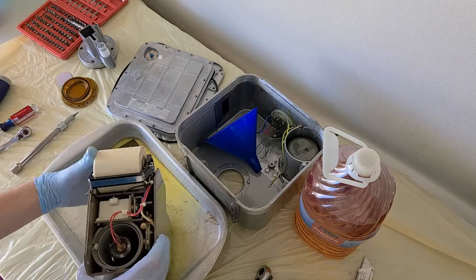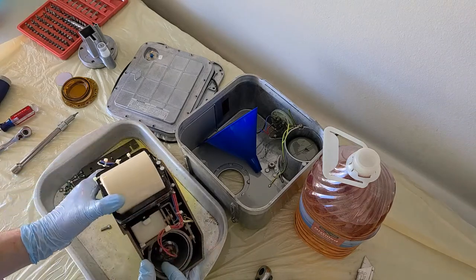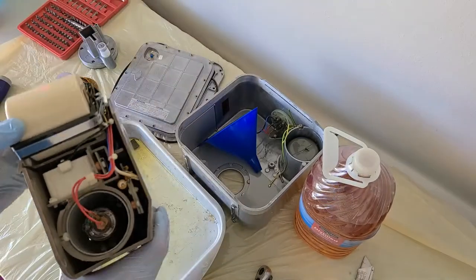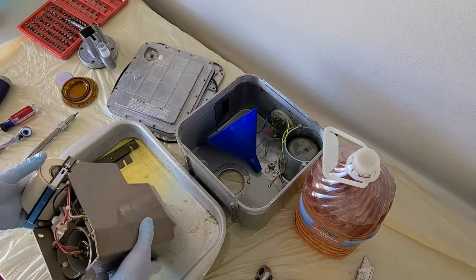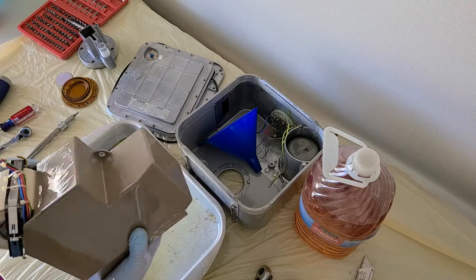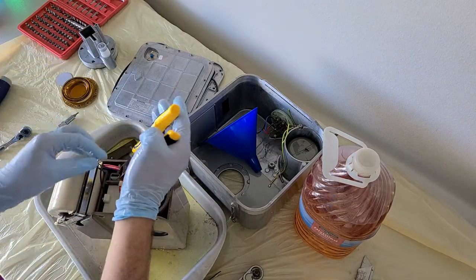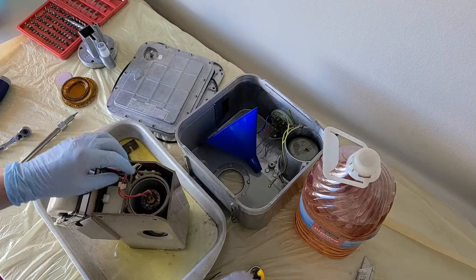It's definitely a small one. It looks nice. Just remember, this was from a Panorex unit. It's a little dental tube. Just keep in mind, everything is extremely oily. It's really slippery.